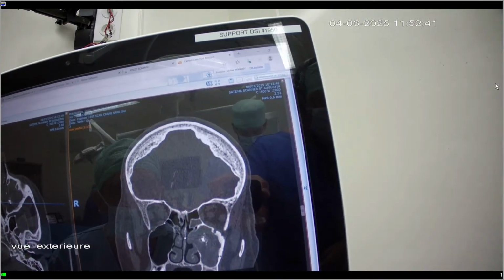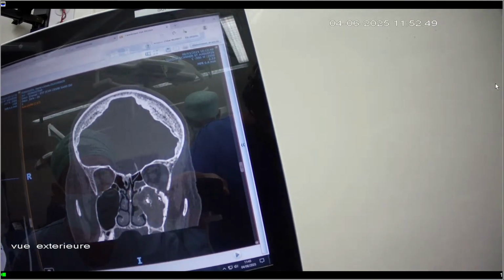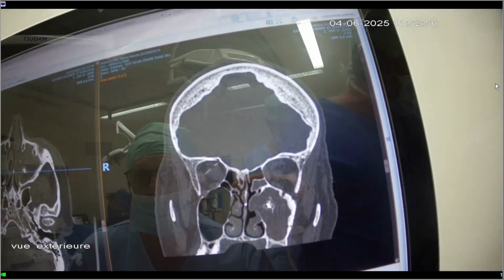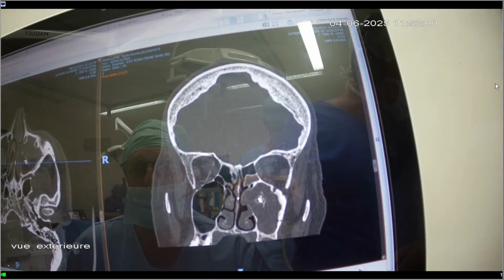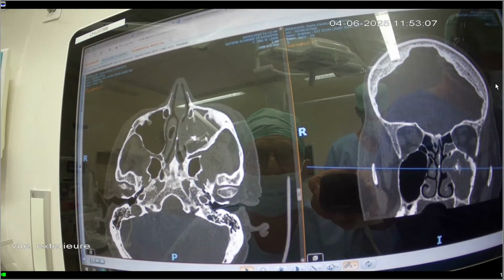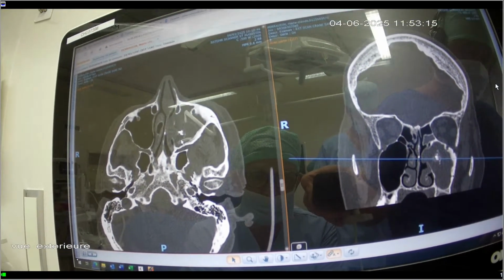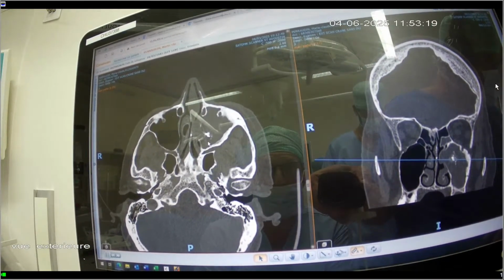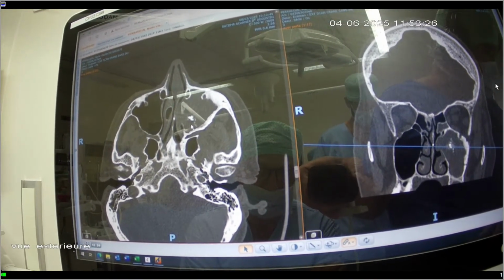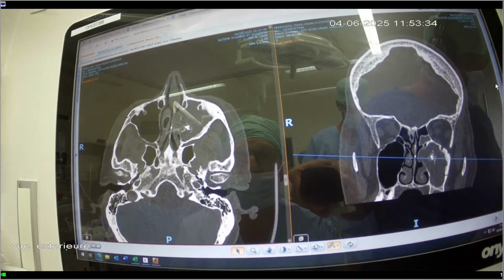And as you can see, due to the fact that she suffered from several periods of suppuration, you have hyperostosis of the wall of the sinus. You can compare with the other side. Look at the thickness of this posterior wall of the sinus, due to the fact that you have associated with the fungus ball chronic suppuration with acute crisis. So it's a polynuclear process. For the fungus ball, this is an eosinophilic process, and for suppuration, this is the polynuclear process which provoke this hyperostosis, osteogenesis.